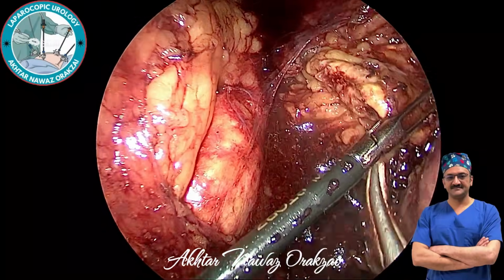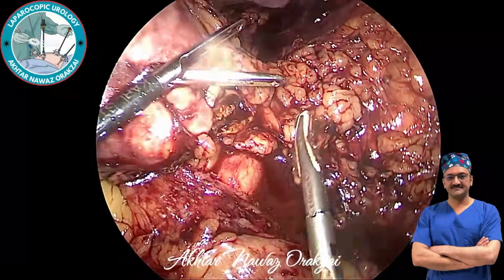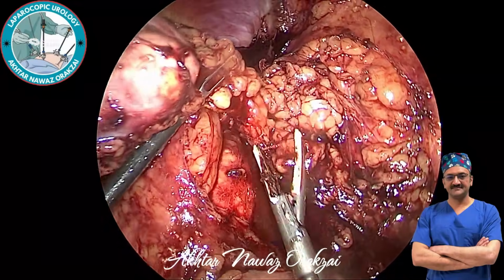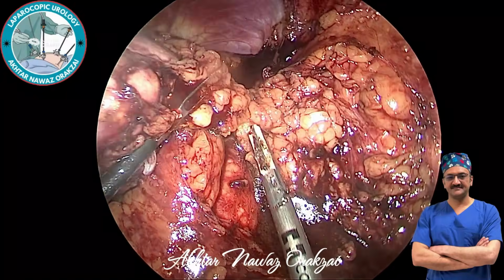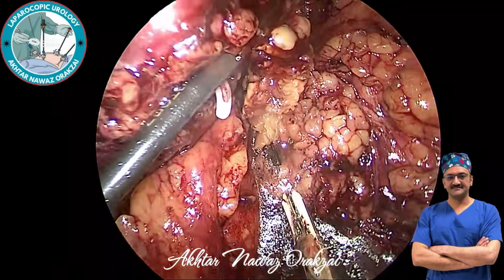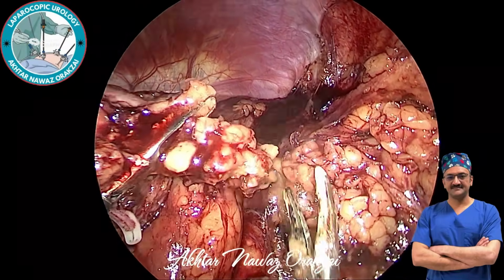So this is the normal part of the adrenal gland. You can see you can move it around here and there, keeping in view the structures, because the tail of the pancreas is nearby, colon is nearby, the splenic vessels are nearby. So while applying the sealing device and cutting it, one must be really careful.